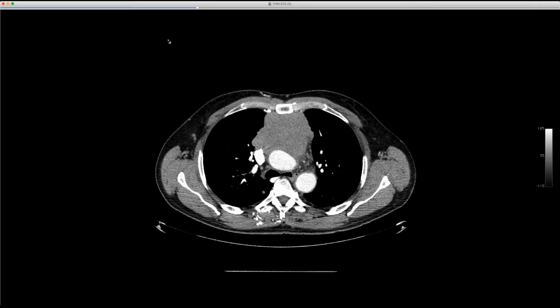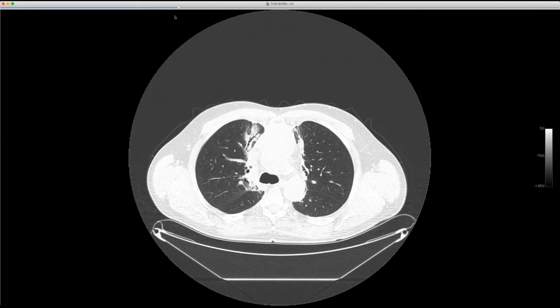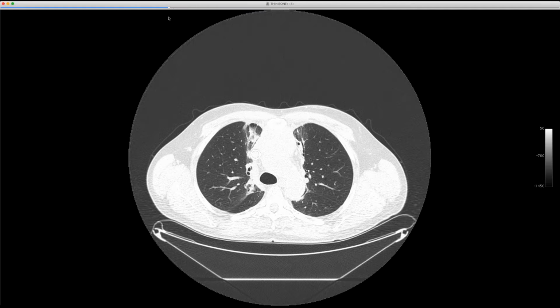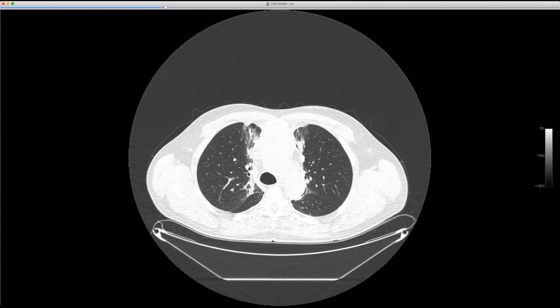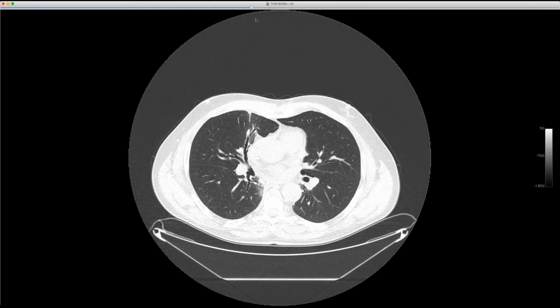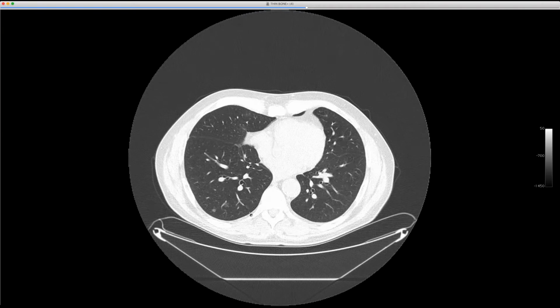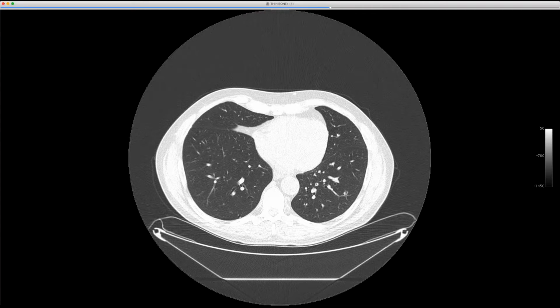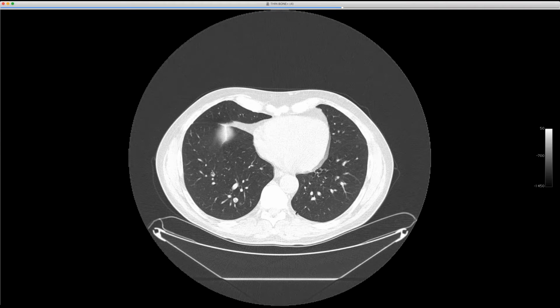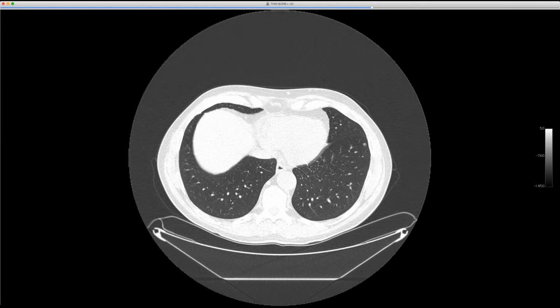He had been given chemotherapy, radiotherapy, and this is the scan from December, which shows that the mass is much smaller, and you can see the radiation-induced injury, classic postage stamp radiation. But that's not why I'm showing this case. What was different on this scan is he had developed, and these were all new compared to his scan from a few months before, these little Cheerio lesions, which I presume are metastases. Gosh. But I've never seen a thymic carcinoma.